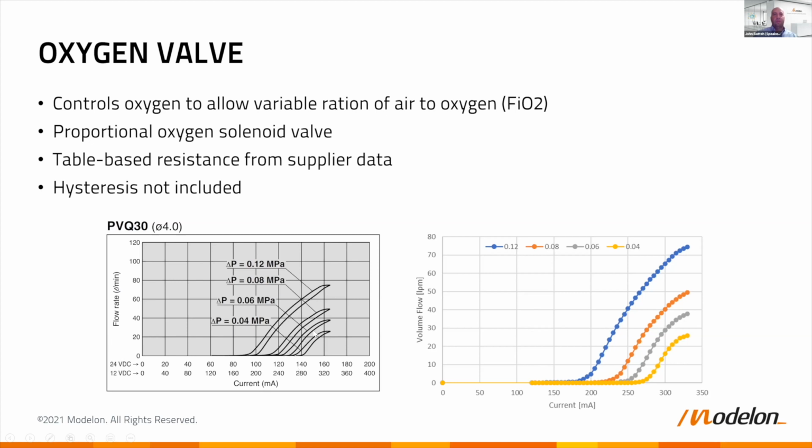You can see there's clearly hysteresis from opening and closing. We did not model that, and you'll actually see later on that there's some evidence of some results deviation because we did not include the hysteresis, which is clearly there in the raw data.